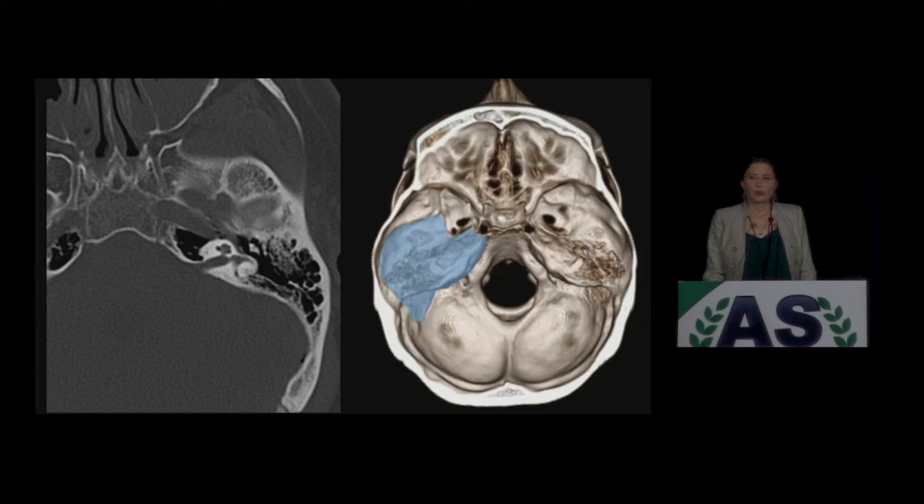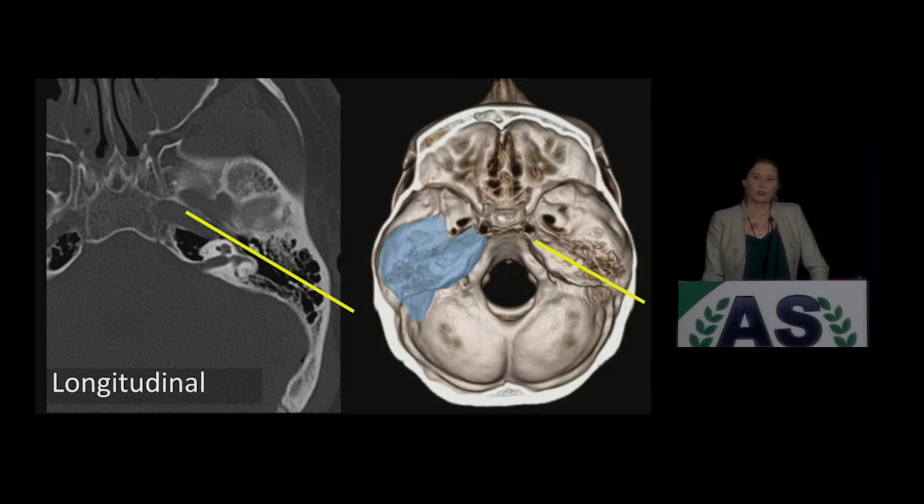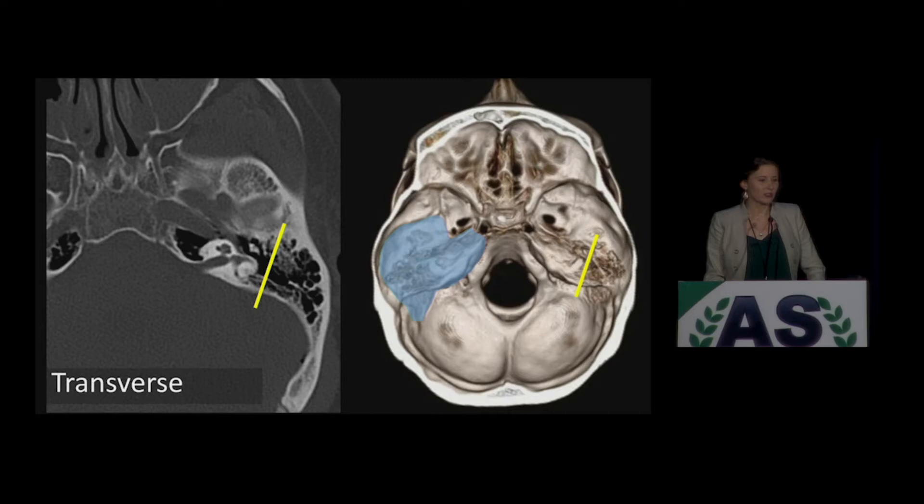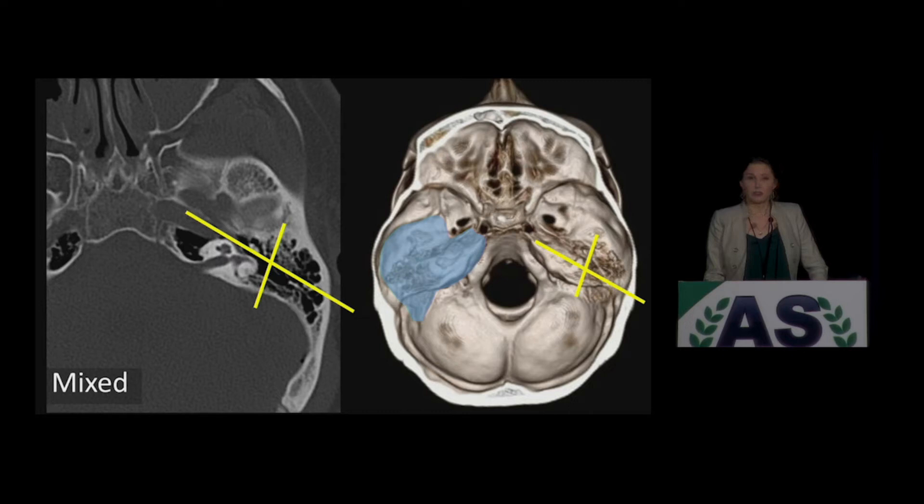What you would do is draw a mental line down the axis of the temporal bone. If the fracture goes along that line, then you would call it a longitudinal fracture. If it goes in the other direction or across the temporal bone, then you would call it a transverse fracture. And then if it has both, then you would call it mixed.